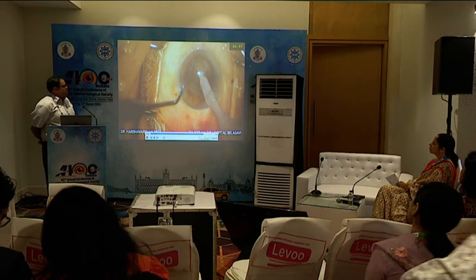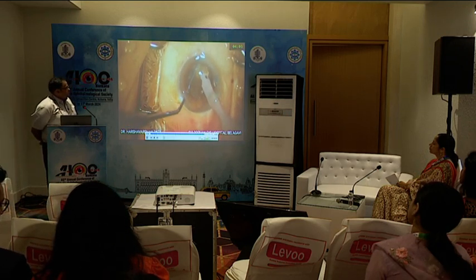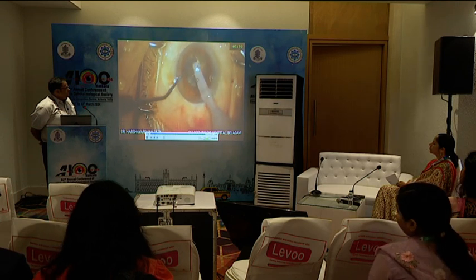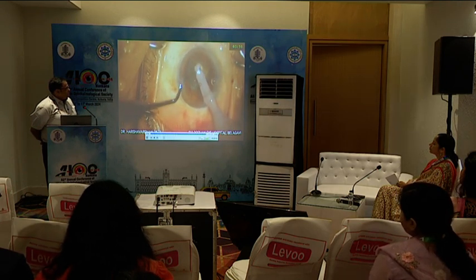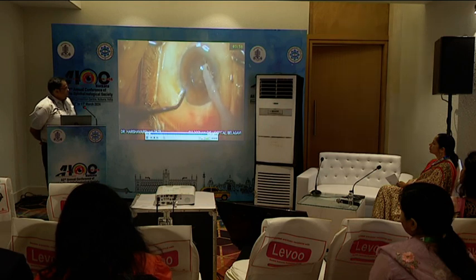See, you can see this is a total hard black cataract, grade 5 nucleus sclerosis. I embed the phaco probe. See with the Harshnag chopper what a good amount of lateral traction you get. You can see the red glow there. So nicely the pieces are separated. Similarly, I repeat the procedure onto the other side.